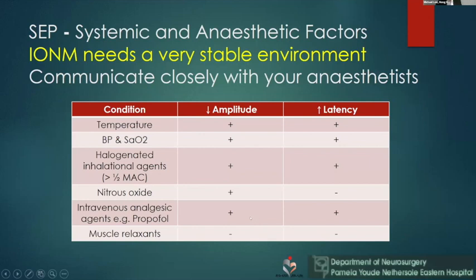So you have to maintain a stable plane during the surgery. That is, not to change the anesthetic agents too much during the surgery. However, for the somatosensory potential, muscle relaxant will have no effect on the amplitude and latency. But if you are measuring the EMG or the motor evoked potential, then probably you should not use the muscle relaxant.